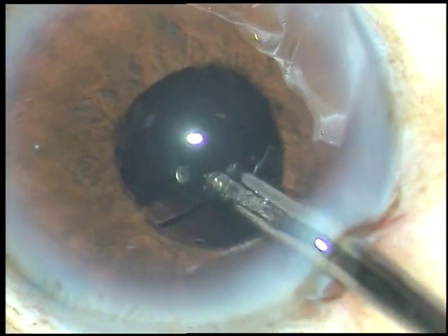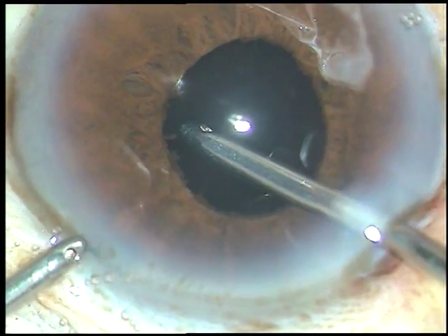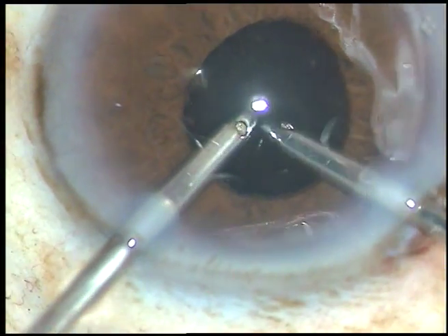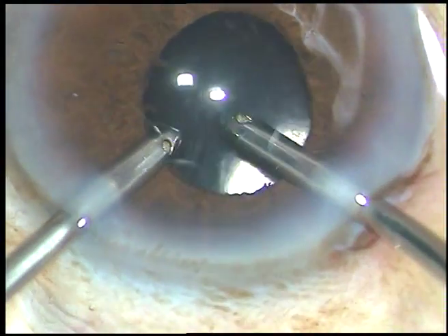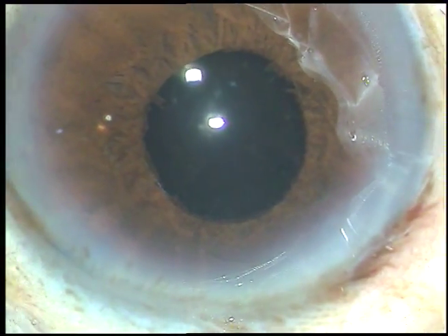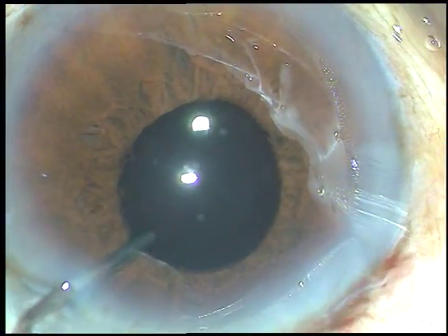The viscoelastic substance that has been used is being thoroughly removed — the visco behind the IOL, what is there in the capsular bag, and what is there in the anterior chamber — everything is nicely removed. Since the irrigation is going to the main incision, I must check if the anterior chamber becomes shallow or not. This is a bit of moxifloxacin.